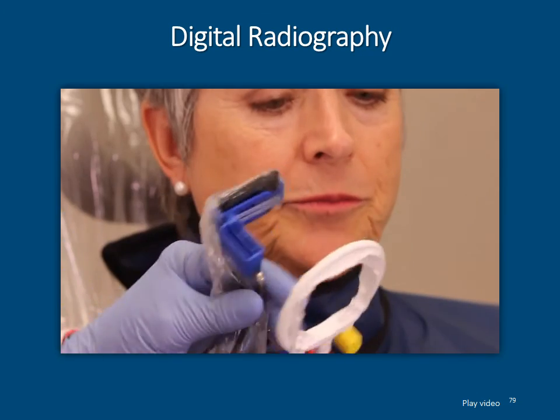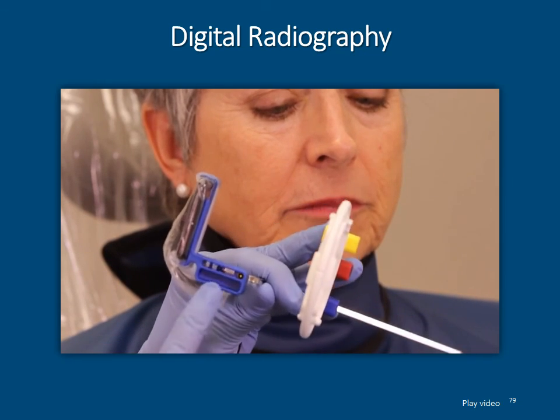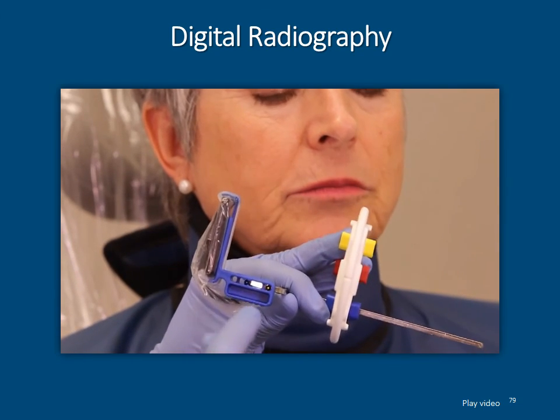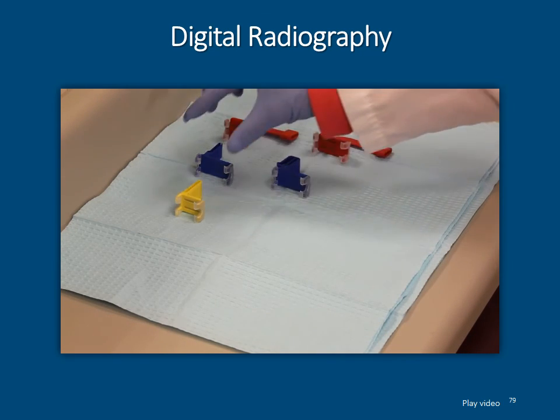Open. Notice on the fit system here, we do have a bite block that's a little thicker than normal. This is great when you're doing the anteriors because you can eliminate having to use a cotton roll. The last area I'd like to show you is the posterior PAs.